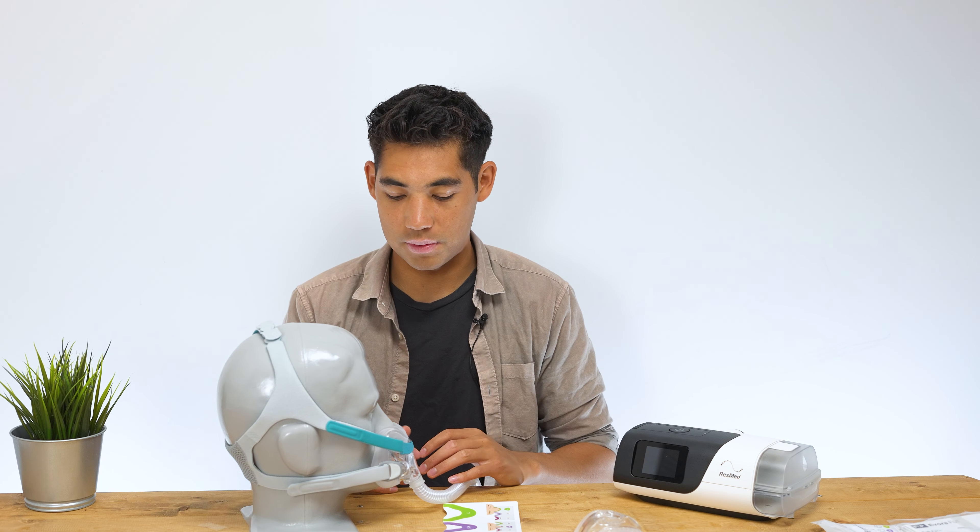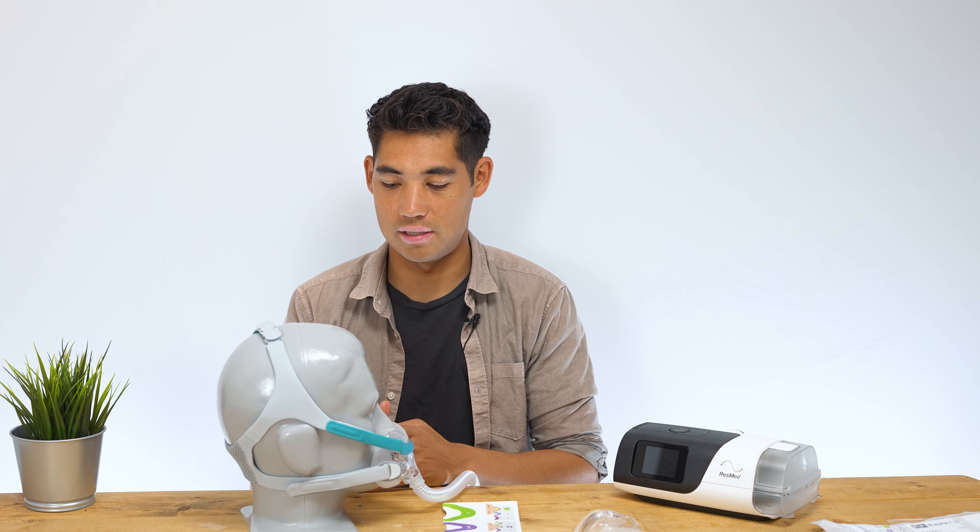Hi everyone, welcome to the CPAP store. My name is Tristan and today we're going to be looking at the Evora Full Face Mask by Fisher & Paykel. This is an interesting full face mask just with the design overall — it doesn't really look like anything from ResMed or Philips. Fisher & Paykel definitely go their own way with their own research, and it kind of stands out amongst many other masks.